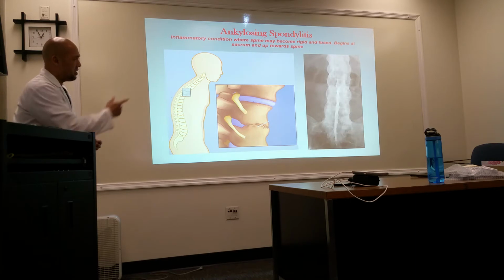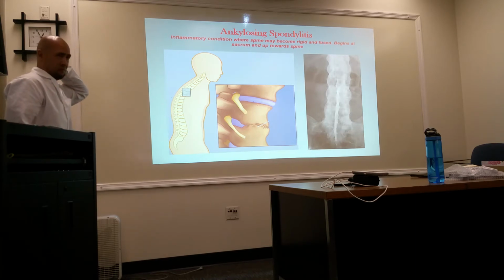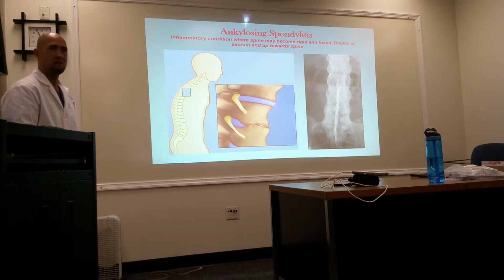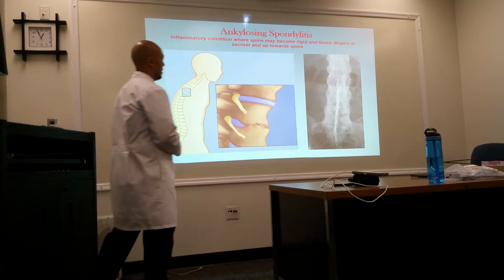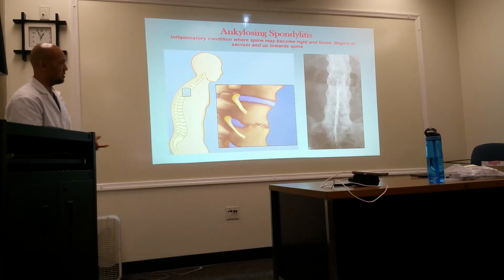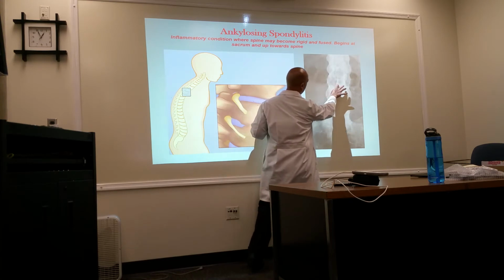All right. You see anything unusual about this AP lumbar? Yeah, it was going through the center joint. Okay, other than it looks like it's fused, do you see that there is an increased density? It's really, really wide. So there's an overproduction of some bone going on over there. And there is some fusion because you're not seeing the spaces in between the spine.